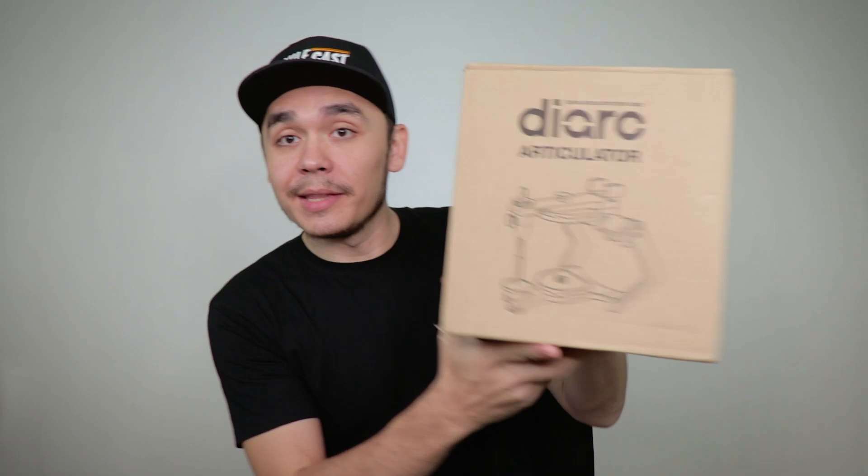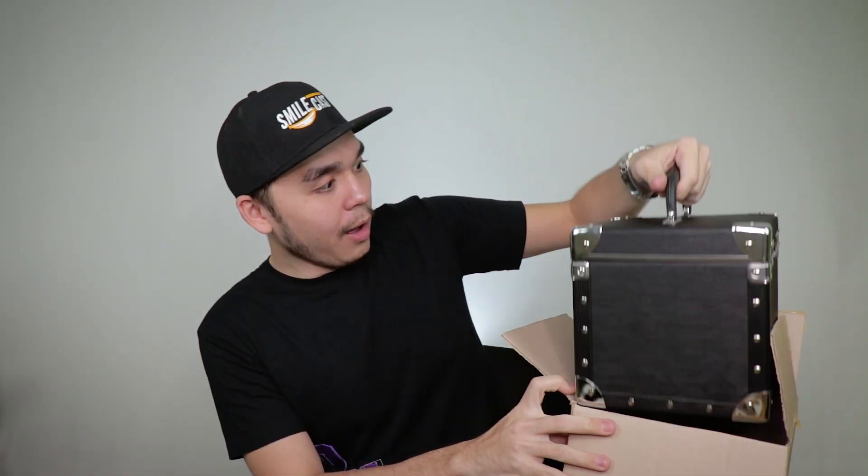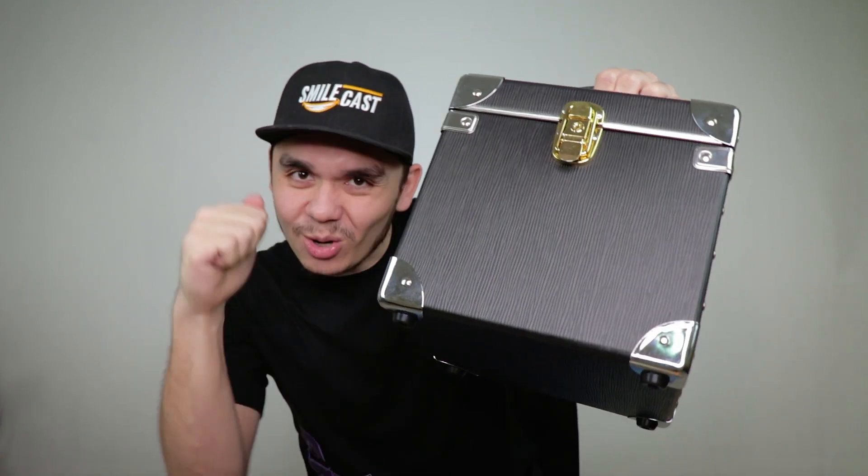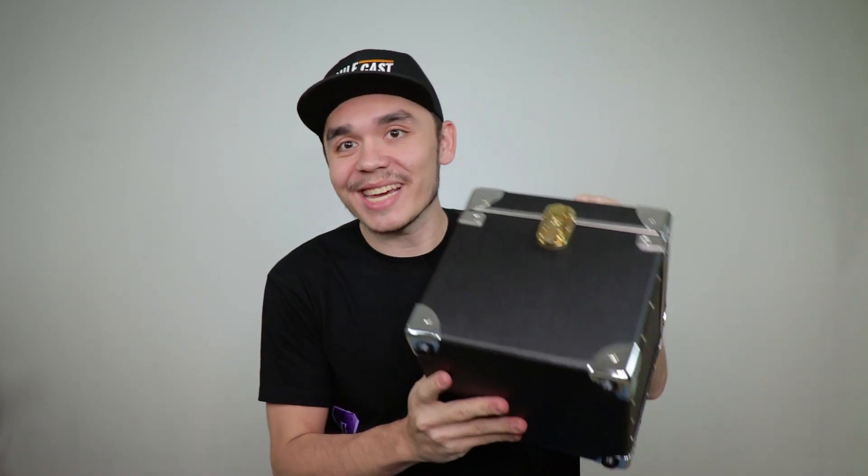Let's take a look at the box. This is the box, this is what it comes in. Open it up and you get this hard case. Nothing speaks premium like getting your own hard case. It's a solid build and it's nice of Cordon to throw this in.